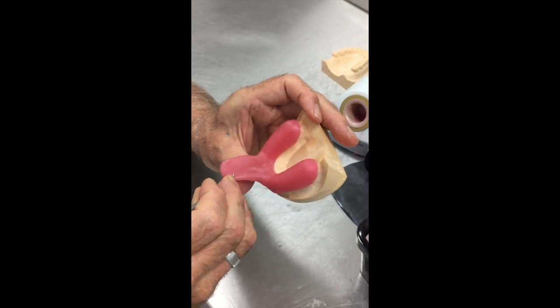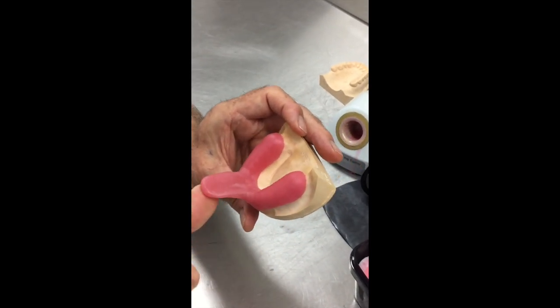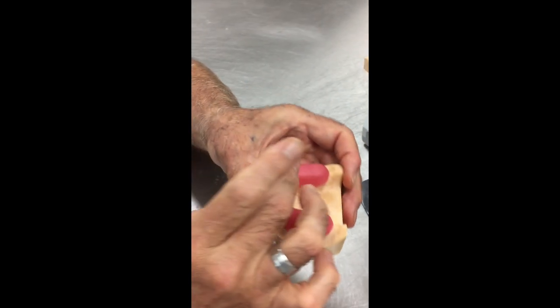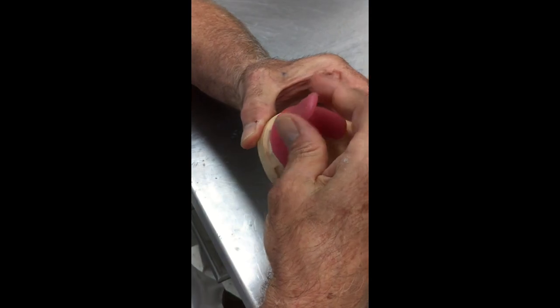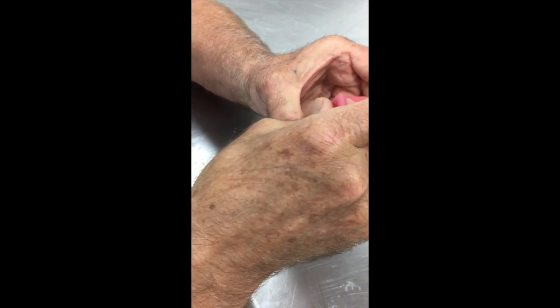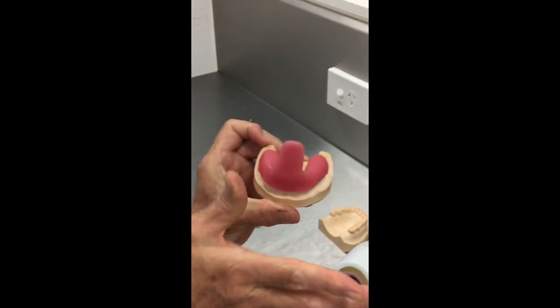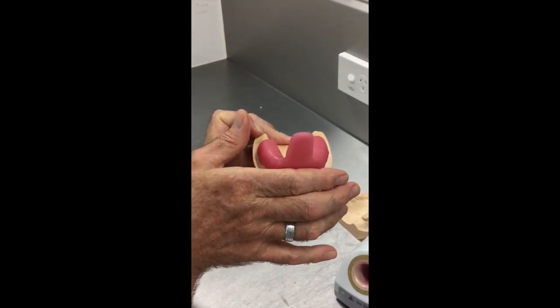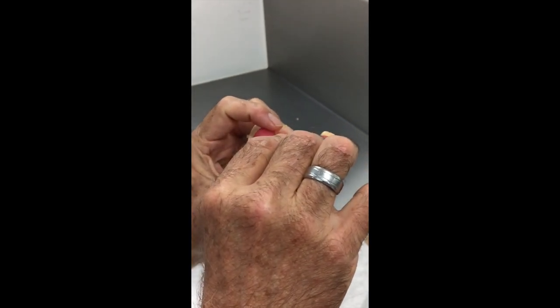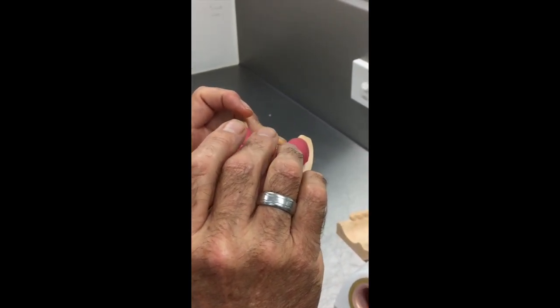A little bit of something in the tray there, we'll take that off, and then we'll blend that handle in. Okay? Once I'm happy with the shape of that, I'm going to take this, and remember that this is a dentate model. The lip is going to be sitting about there at the height of the teeth, coincidental with the incisal edge of the teeth.